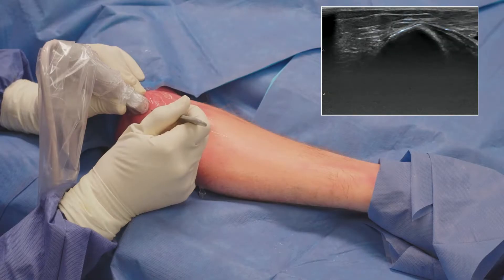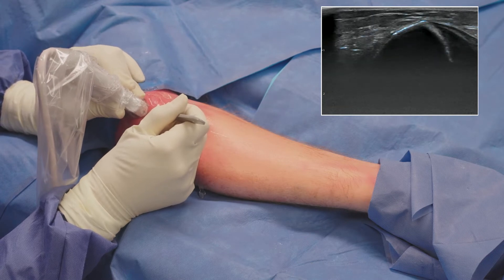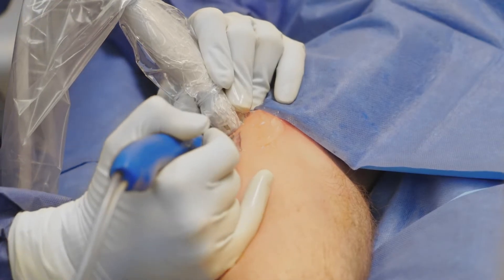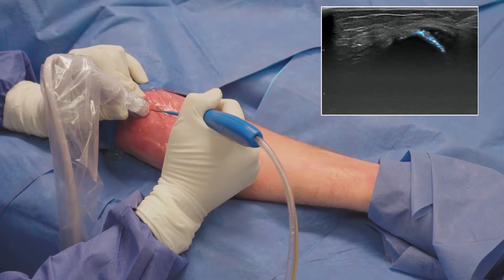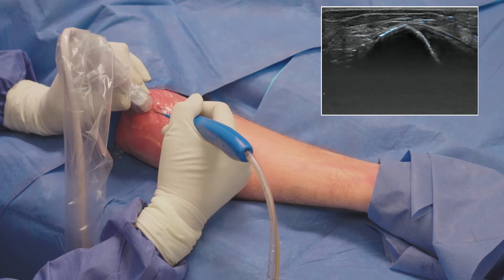Using an 11 blade scalpel, I make a small stab incision down to the tendon to create a pathway for the TenJet device. Once I have created a pathway, I guide the TenJet device toward the pathology and towards the cortical structure of the bone. As you can see on ultrasound, the TenJet device going down towards the diseased tissue is identified.